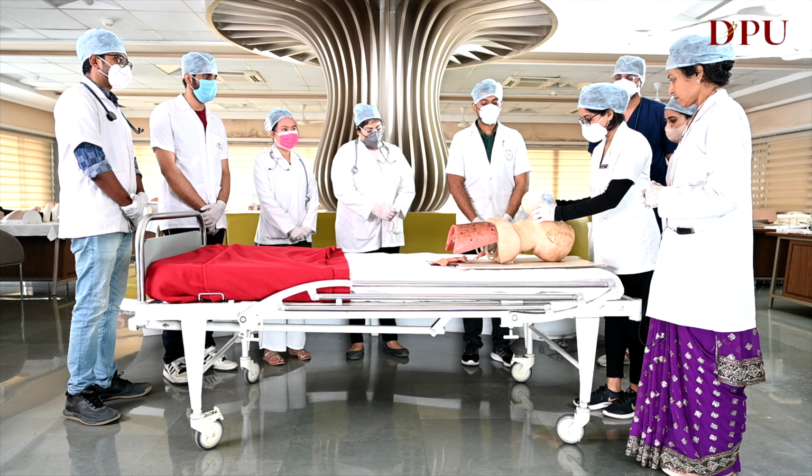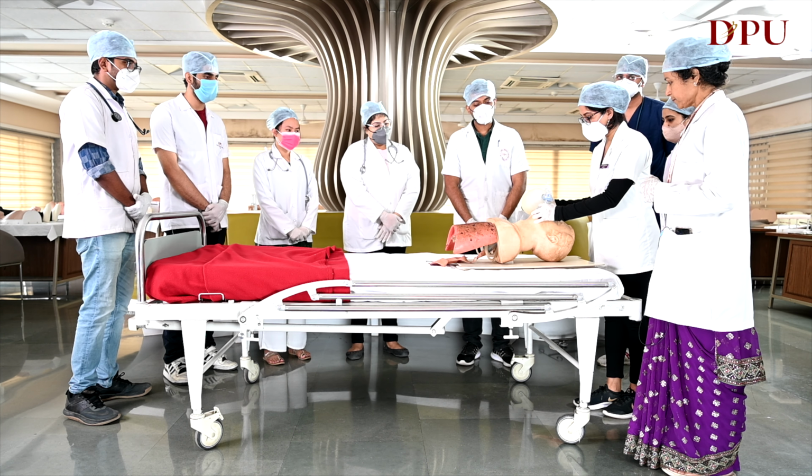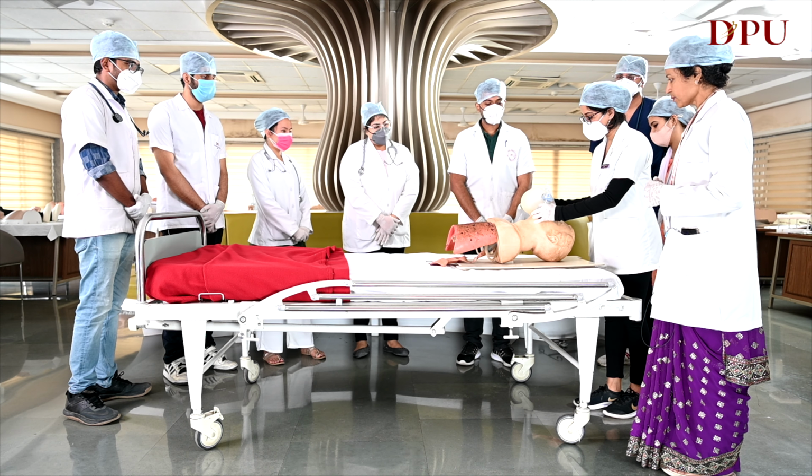Very good. 1,000, 1; 1,000, 2. Everybody can see the lungs are inflating. 4; 1,000, 5; 1,000, 6; 1,000, breath.